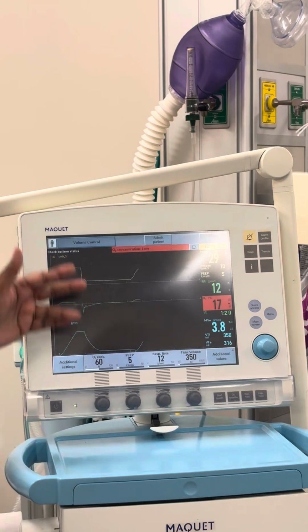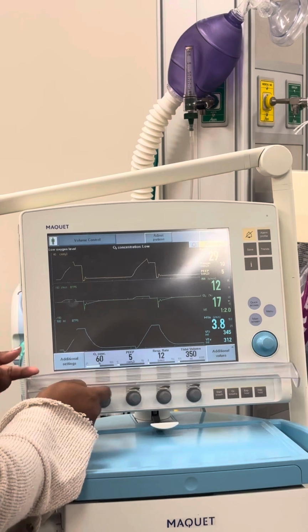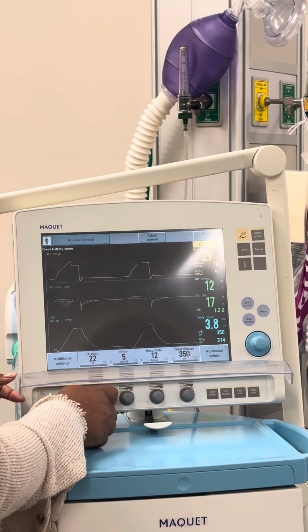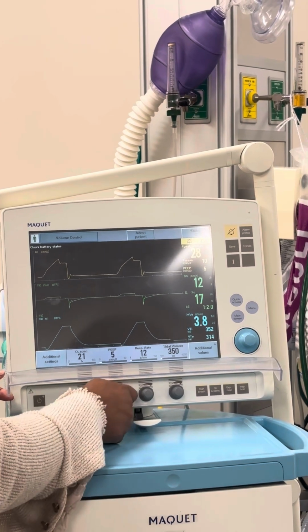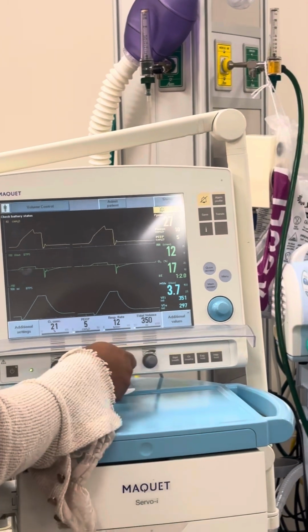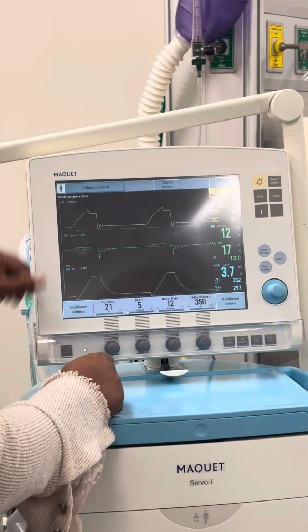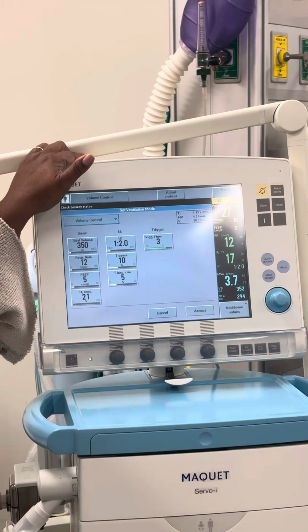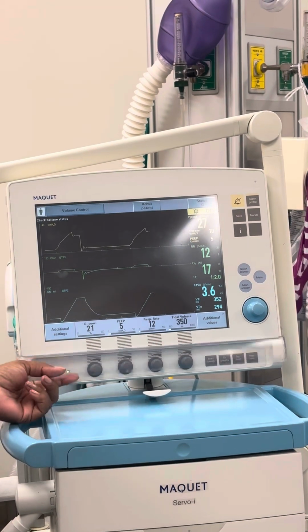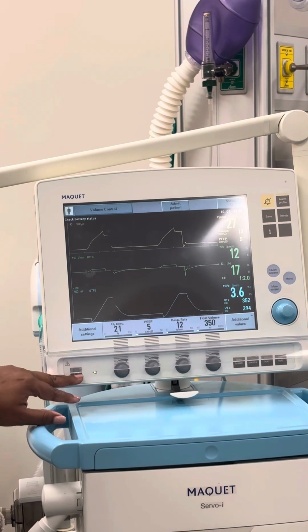But what if I don't want to adjust them there? I can actually adjust them here. Look at that. You can adjust your settings here, or you can go back up here. It's just giving you 2 options. If you feel like going through and flipping this up, you can. And if you want a quick power off, you can do that here.